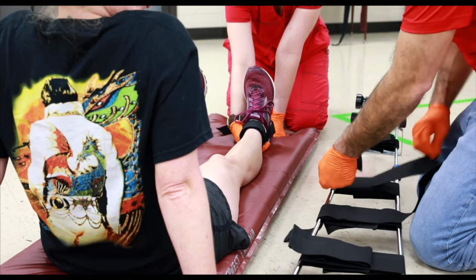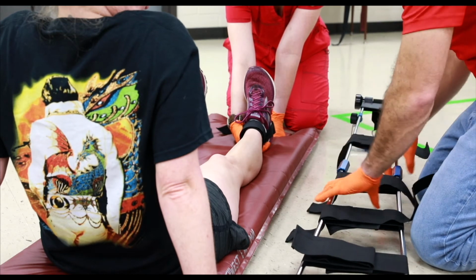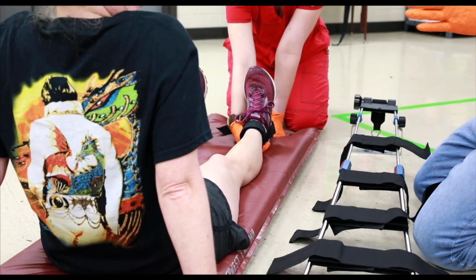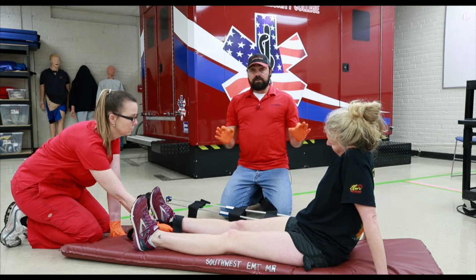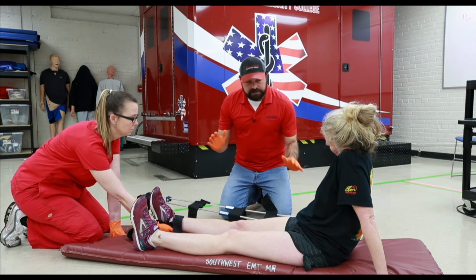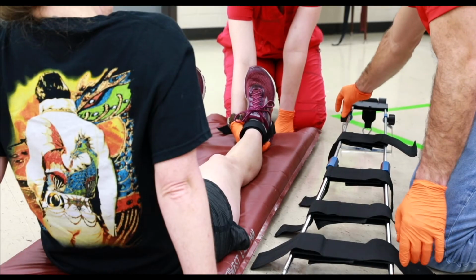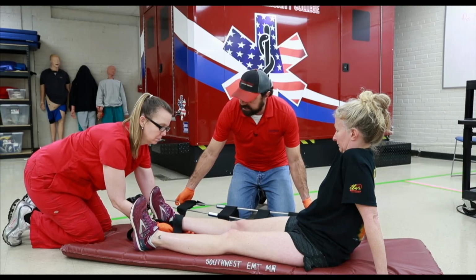You can open up the leg straps. The goal here is to have 2 straps above and 2 straps below the joint of injury. So you're going to have 2 above the knee, 2 below the knee. The key also is to make sure that you don't place any of these straps over the fracture site. So if you kind of can tell where the fracture happened, you want to make sure that you don't place a strap over that. So once you have it to the desired length and you're ready to go, you'd have your partner on 3, gently lift up, and you're going to slide this into place.